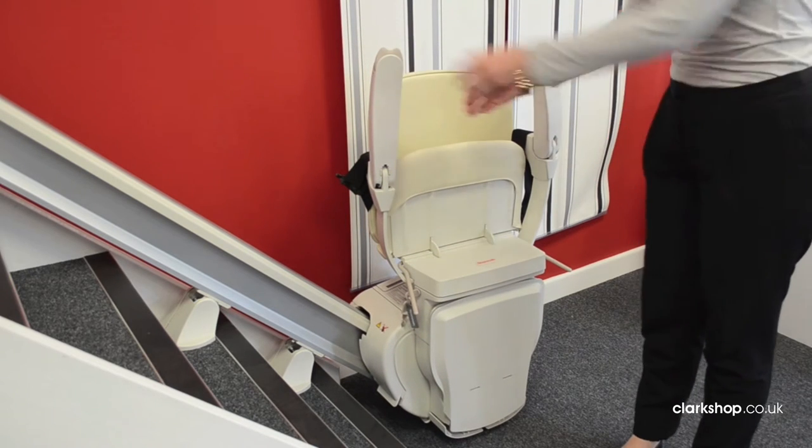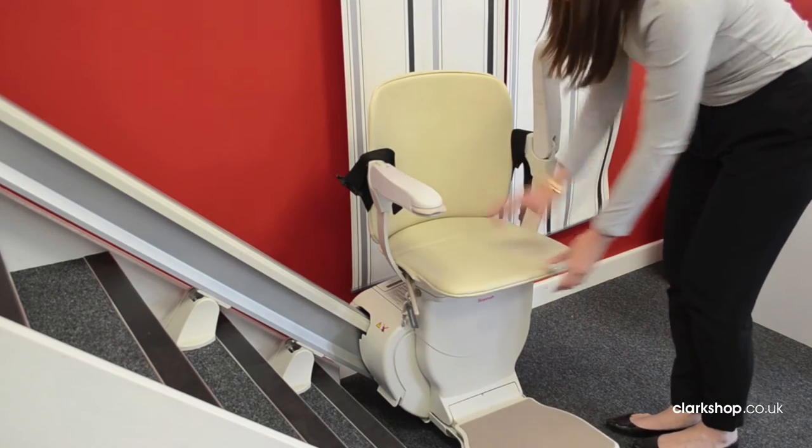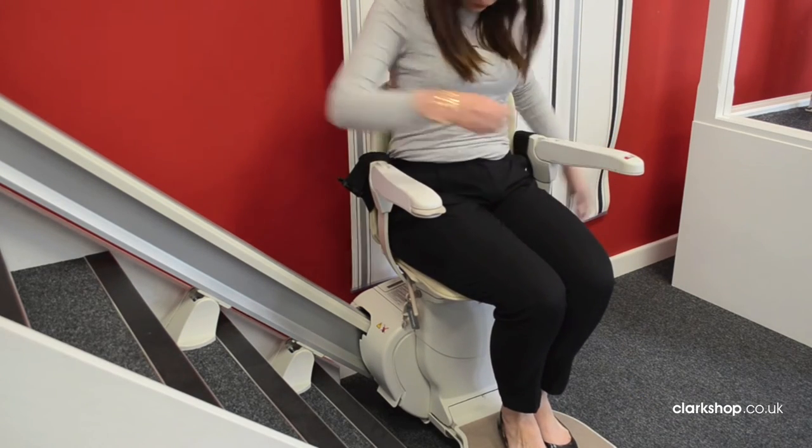Once the stairlift is in the correct place for you, simply fold down the seat, arms and footplate. Take your seat and fasten your safety belt like so.